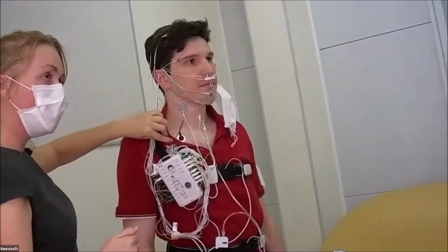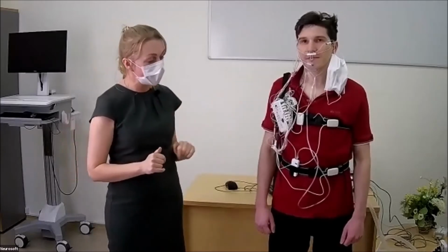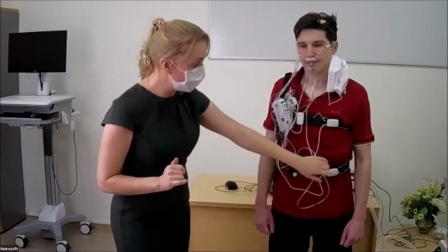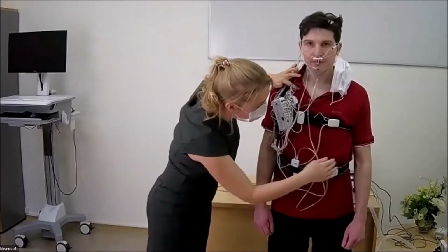And we can use different types of electrodes. We can use the single-use electrode, as in this case, or we can use a reusable cap electrode for it. This is the first electrode, and we use the bipolar electrode. It is one electrode, and another electrode we put below the chest, in the 6-7 intercostal space at the anterior axillary line. So we have two ECG electrodes here and here.